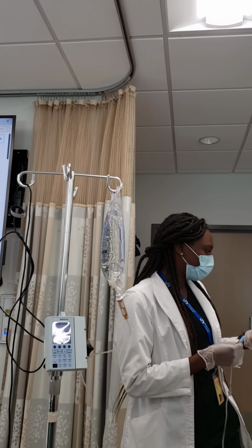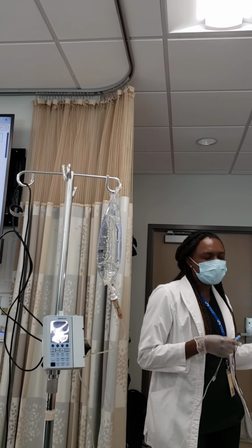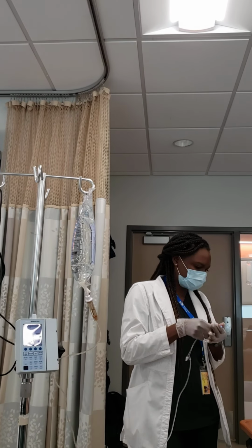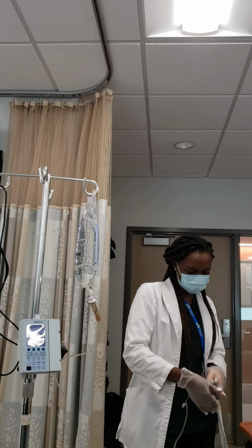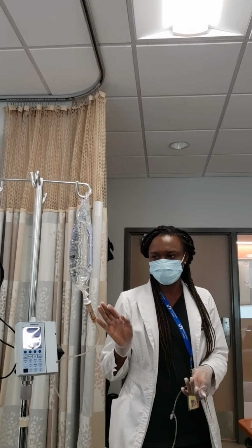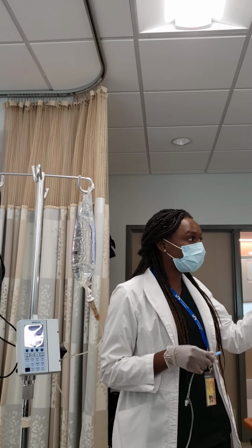You can use a trash can. Well, I don't like the trash can because I think the trash can is dirty. I just don't like trash cans. Even though you're hanging it above it, when you're entering the fluid, I don't like it. But anyhow, you can use that, gloves, etc.